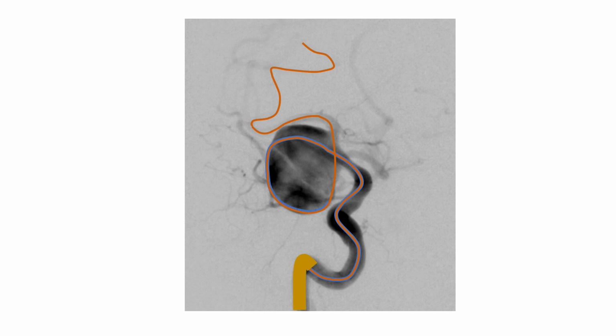Now you take your micro, and let it be a soft micro, the softer the better. What I normally use would be a 17 microcatheter, which I use for coiling, and take it as distal as possible. Once you've done that, pull the wire out. That is the secret. If you keep the wire in and pull, the loop will continue to be retained and the tip will move. If you have a soft catheter like this, without the wire inside, as you pull on the catheter, it will straighten. So fill this microcatheter with contrast and pull back. And as you pull back, it straightens easily without the tip moving at all.